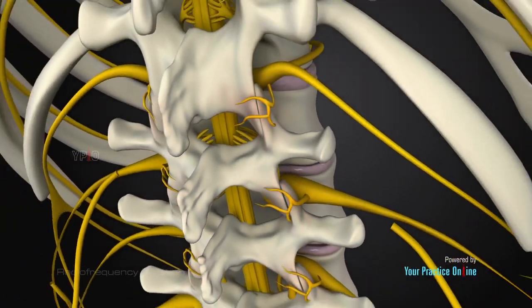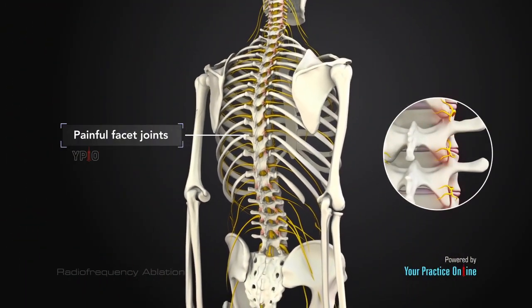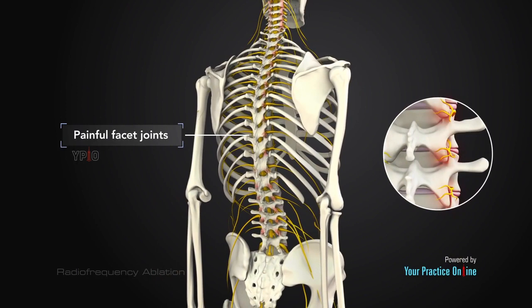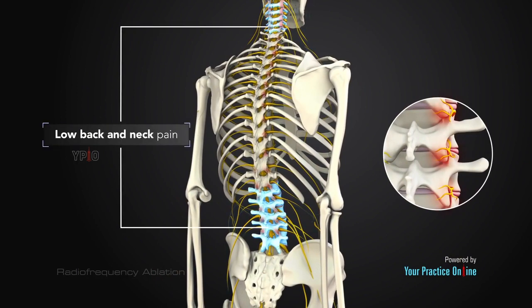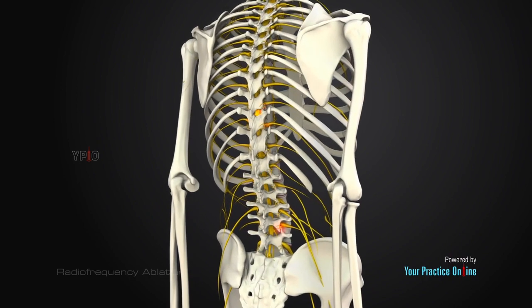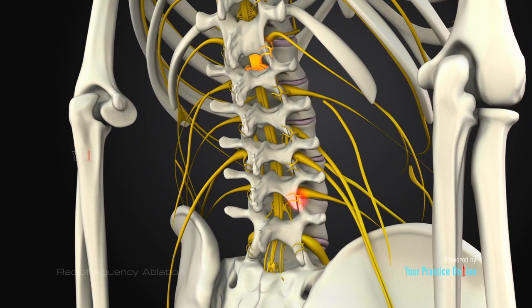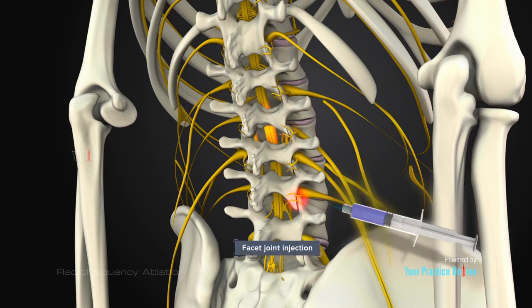Indications: this procedure is performed to treat painful facet joints in the spine that cause chronic low back and neck pain. Radiofrequency ablation treatment is only considered after it is confirmed that the cause of the pain is coming from the facet joints. This is confirmed by performing a diagnostic facet joint injection.